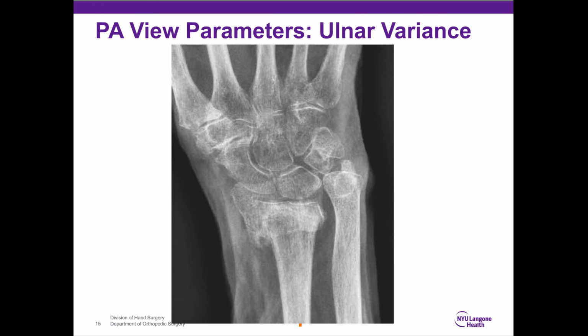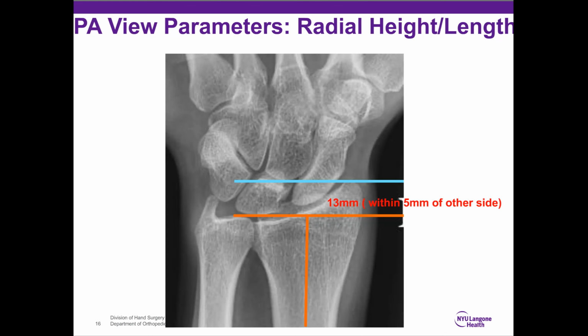So here's a patient who, not pretty x-rays. Like we were talking about, this is an elderly woman who had a standing level fall, insufficiency type fracture. This is just showing there's your central reference point, and that's how you would measure your ulnar variance. At first glance, it may seem like this is underselling it, but you'll see the lateral of this patient later on in the talk.